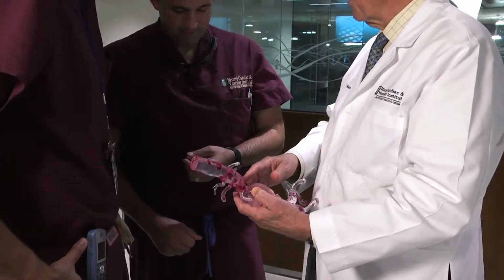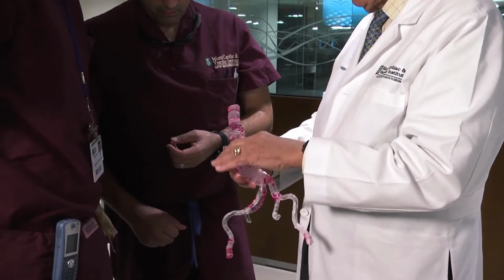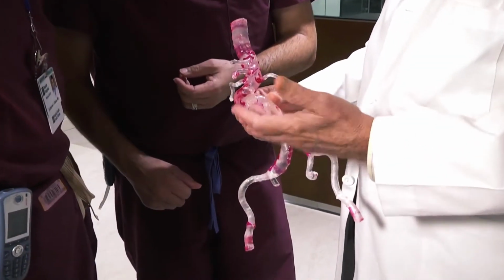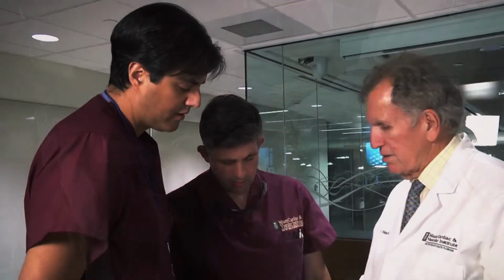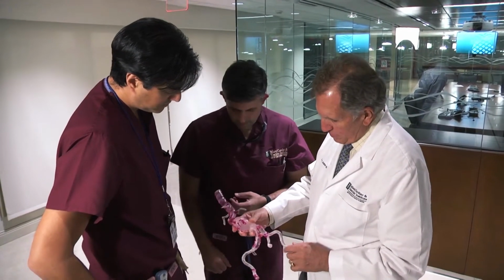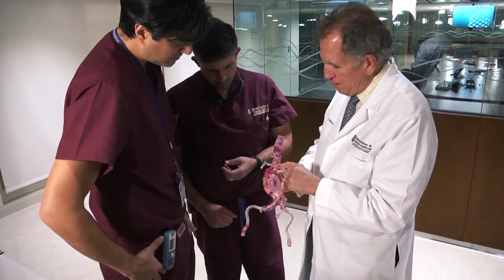Being able to see a 3D model shows us a lot of things, especially as it relates to heart and circulatory problems. When we're treating aneurysms, arteries curve a lot, they angle a lot, they're very complex. And we've seen a number of situations where by looking at a model and looking at the 3D model, we actually change our device selection or change our approach or in some way alter our treatment plan for that patient. So I think it's going to offer a lot of potential for improving patient care in that way.